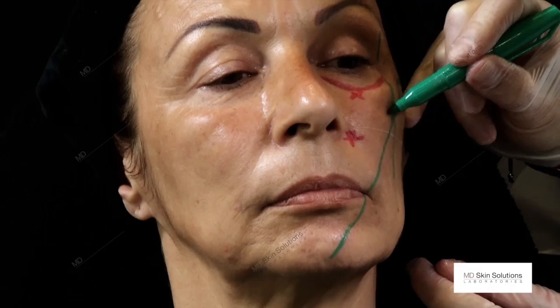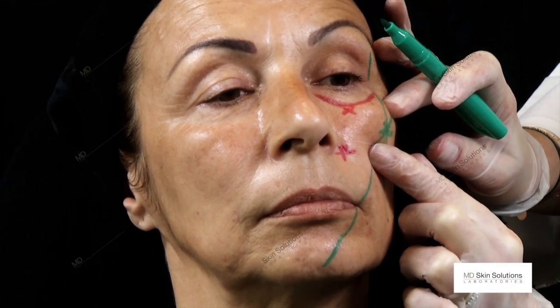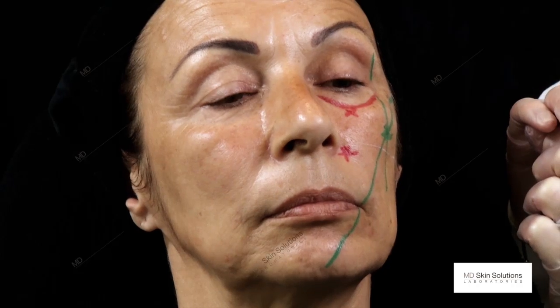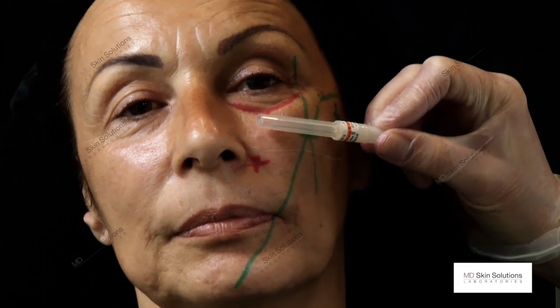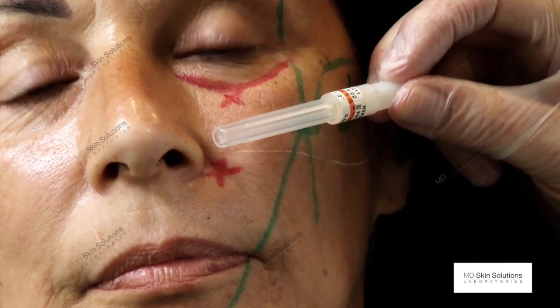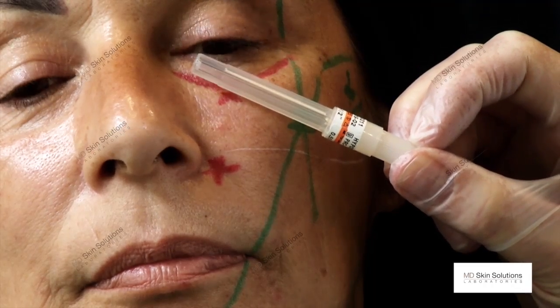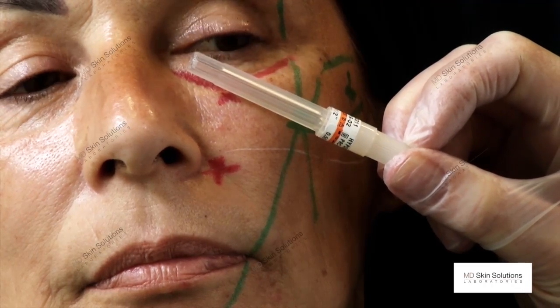This is the highest point where the cheek apex point should be, has been, or will be after the treatment. I can reach out for the whole frontal projection, for the whole area where I will recreate the frontal projection and even the tear trough from this point.